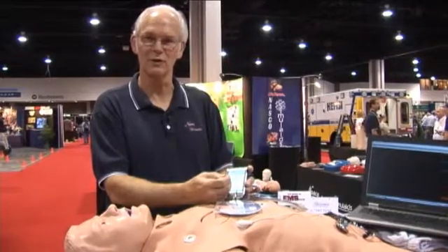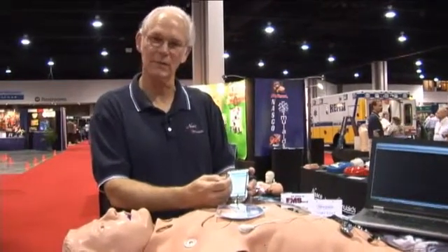Hi, I'm Warren from Simulades. Welcome to Simulades at the EMS Expo. We're booth 1531. Glad to have you here. We're going to show you the SmartStat patient simulator.